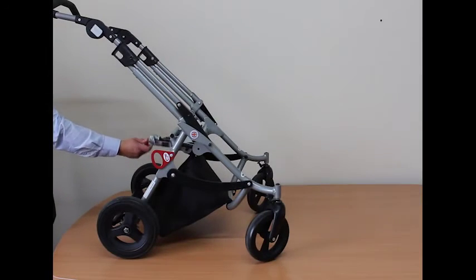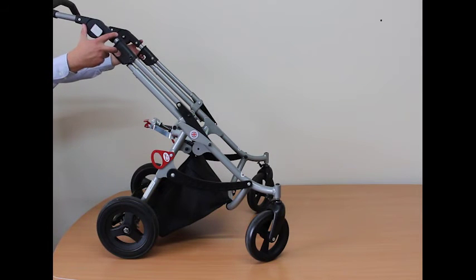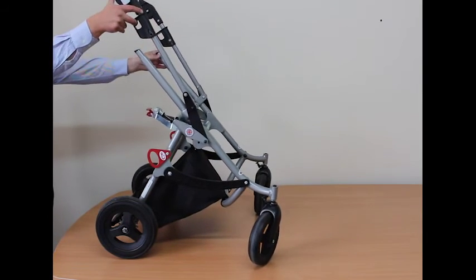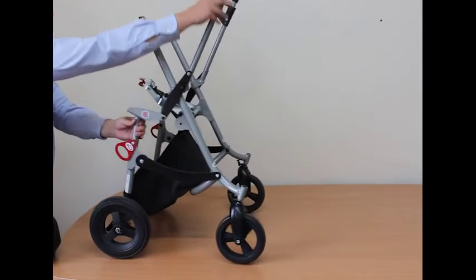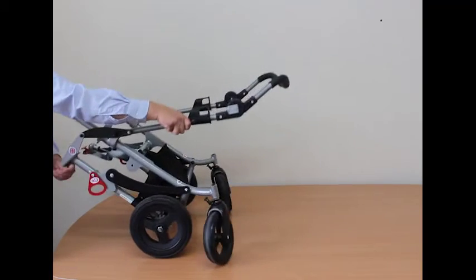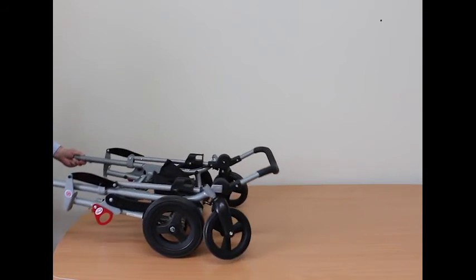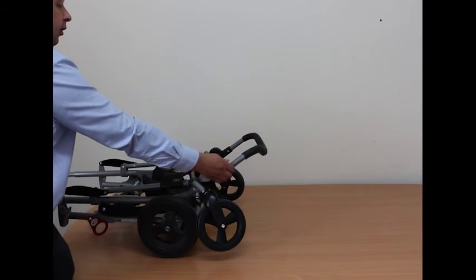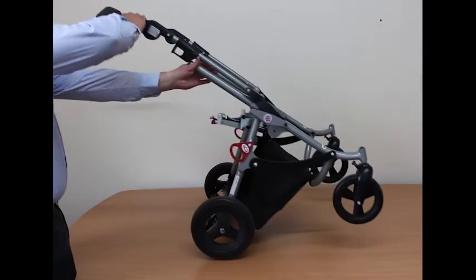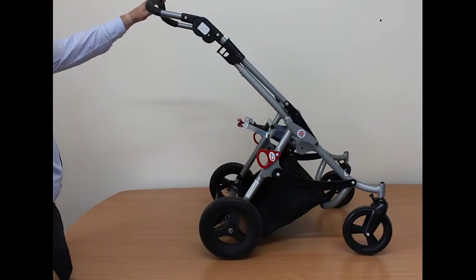To fold the chassis, place the seat carriage tilted forwards. Then take hold of both seat catch releases, release them and fold the frame over. To reassemble the chassis, take hold of the handle and push forward and over, making sure both catches are located in position.